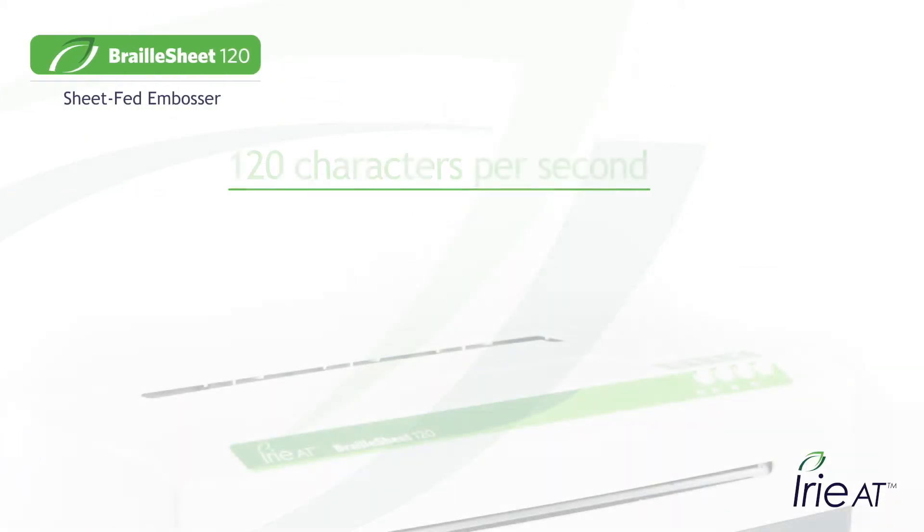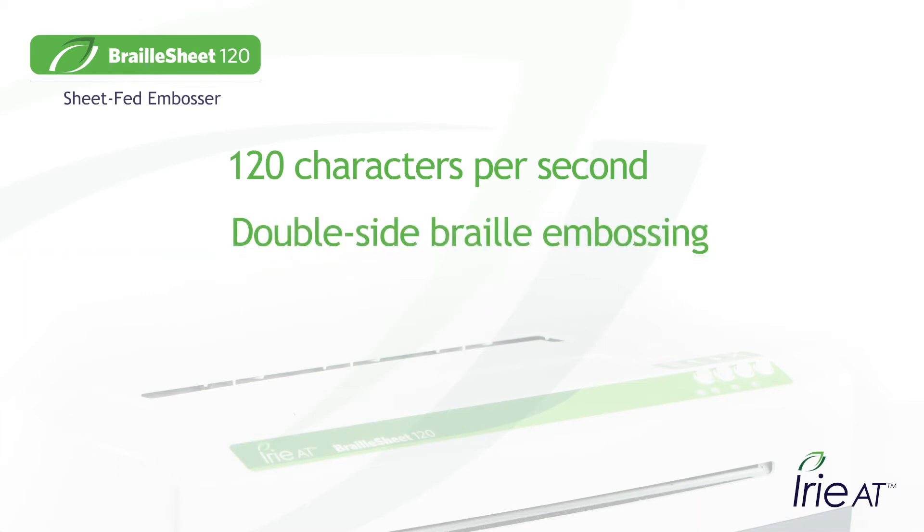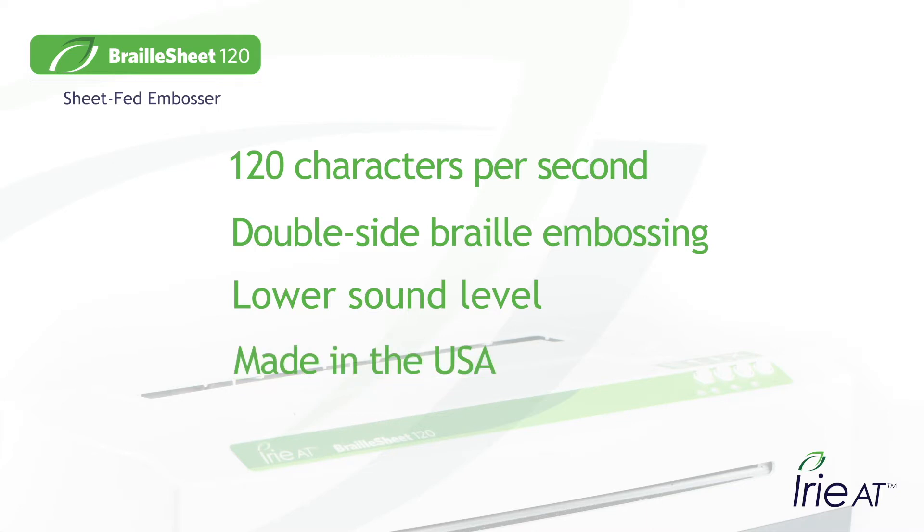The Irie Braille Sheet will crank out your documents at 120 characters per second. Choose from single-sided or double-sided interpoint embossing. Braille Sheet has a lower sound level than other embossers, and the Braille Sheet 120 is made in the USA.